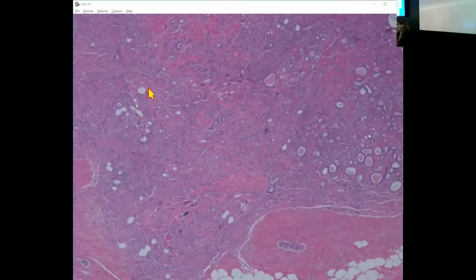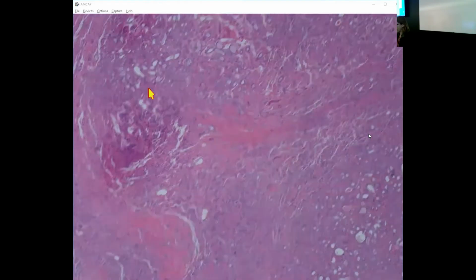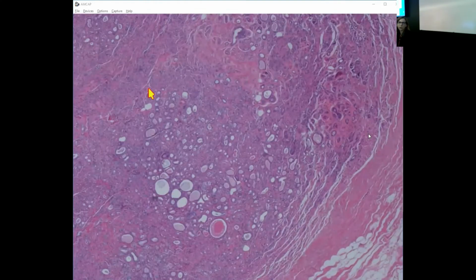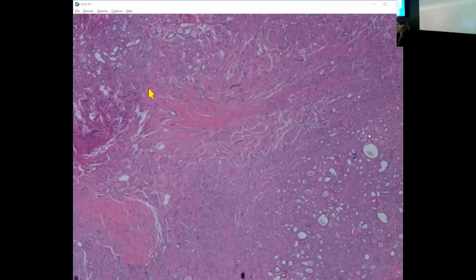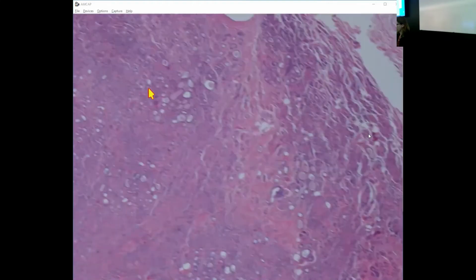And so obviously, the correlate for the imaging finding is the mass. And so something like this, you could call an area of nodular adenosis, or people might call it an adenosis tumor. Or, in some way you need to convey that the sclerosing adenosis is the correlate for the mass lesion. So I think most often we say nodular adenosis is the way I describe something like this.